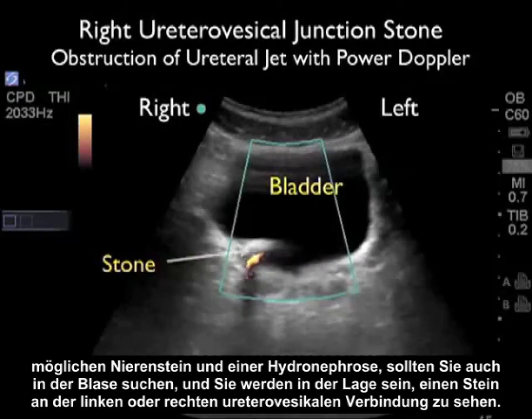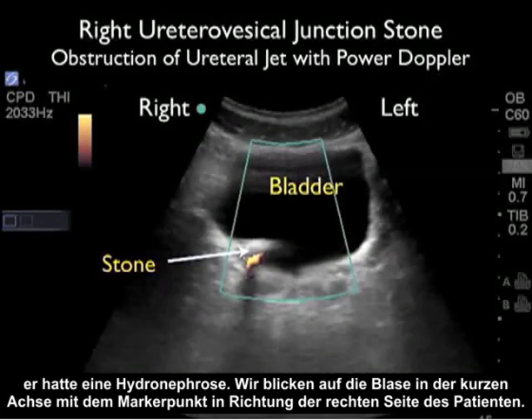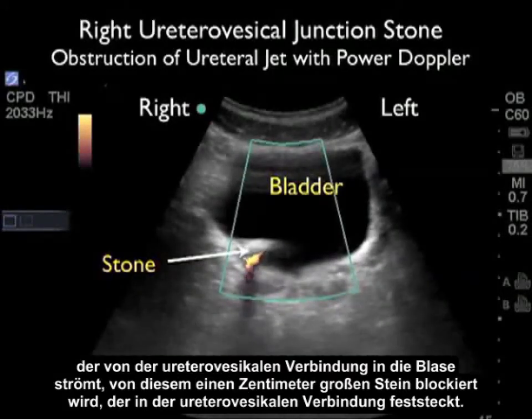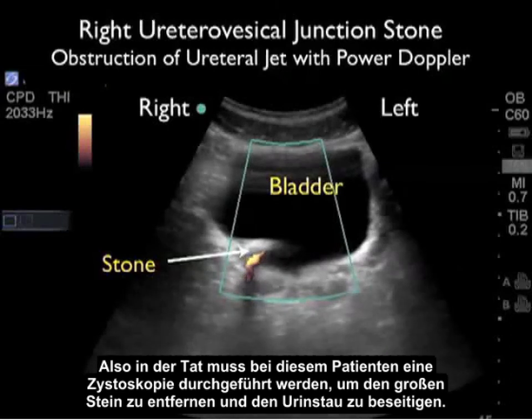When evaluating a patient with a possible kidney stone and you find hydronephrosis, you should also look at the bladder. You may be able to visualize a stone present at the left or right ureterovesicular junction. Here's a case in which a patient presented with right flank pain and had right hydronephrosis. We're looking at the bladder in a short axis configuration with the marker dot towards the patient's right side. We can see a hyperechoic large shadowing stone present at the right UVJ. Applying Doppler sonography, we can see that the ureteral jets — the flow of urine coming out through the UVJ into the bladder — are being blocked by this one centimeter stone plugged at the UVJ. This patient had to go to the cystoscopy lab to have the large stone removed and relieve the obstruction.